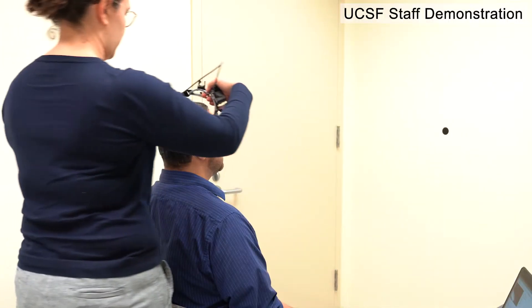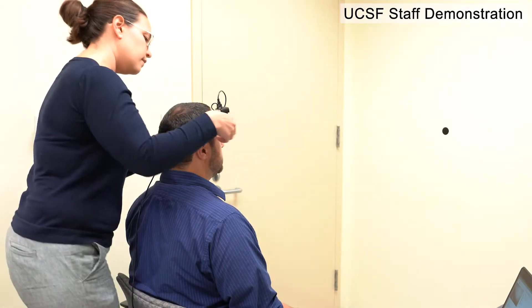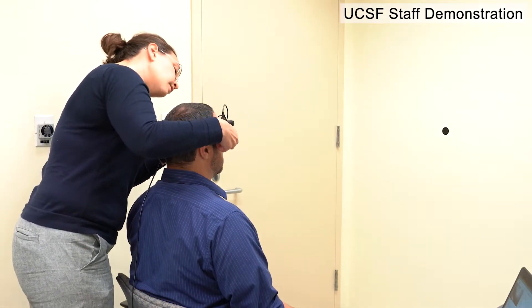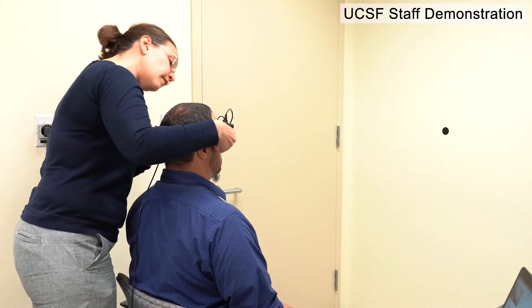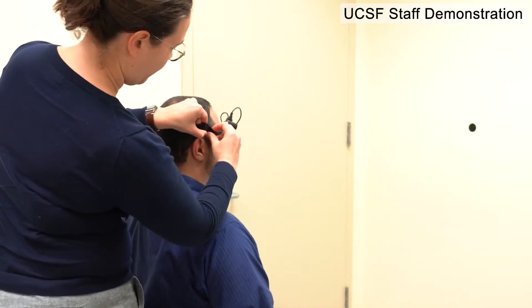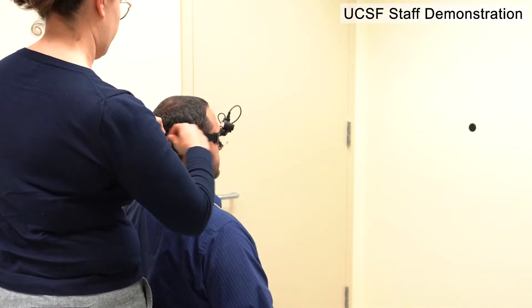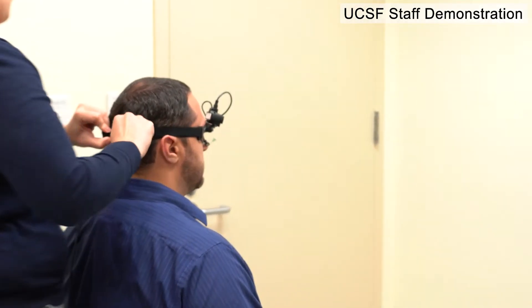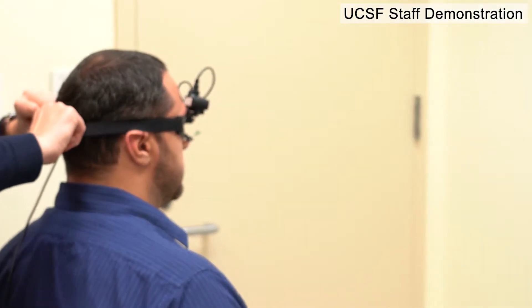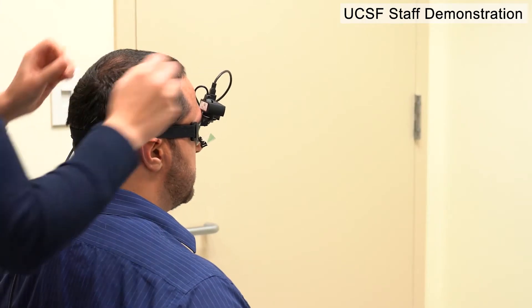During the video head impulse test, you'll be asked to focus your eyes on a target while your head is put through a series of quick rotations, and a high-speed camera will be used to track your eye movements — specifically, to determine whether your eyes stay focused on the target.